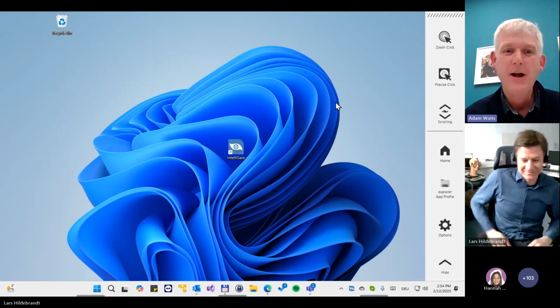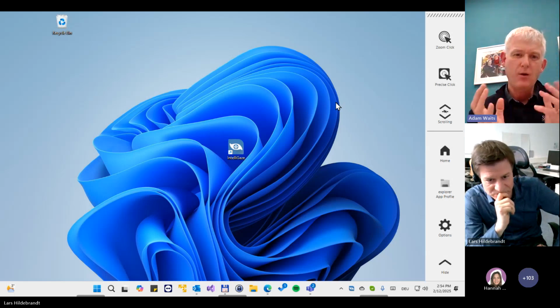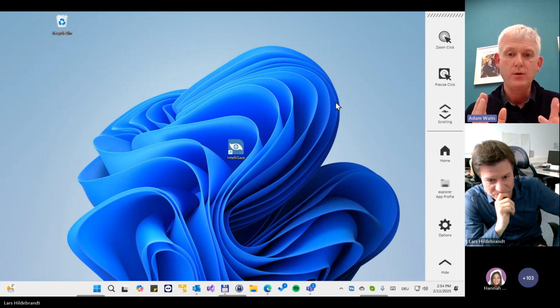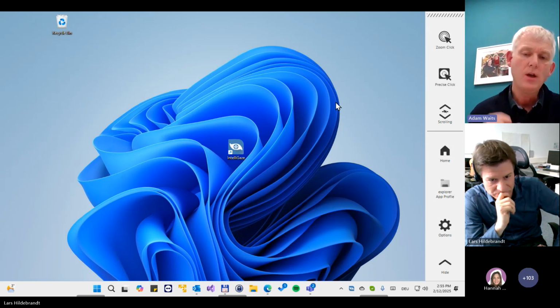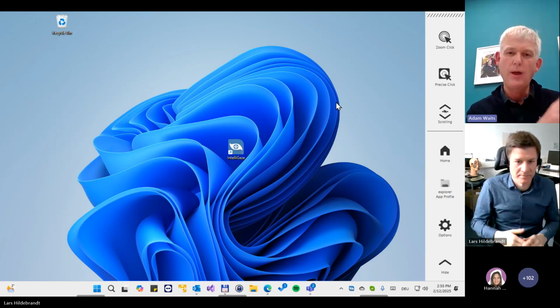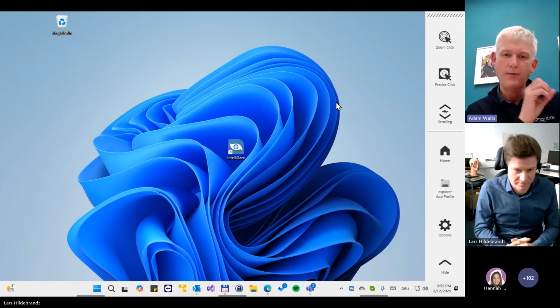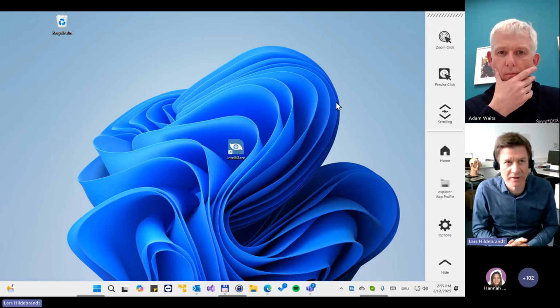So, another question: the forgiving calibration wait, is it long in Grid, or is there a difference when using IntelliGaze? When the calibration waits for the user to look, I think the question is, does it wait in Grid as long as in IntelliGaze? My feeling when I've used both is that it sits there and shrinks and waits for you before finally moving on. Yes, this is what it does in Grid as well, to my knowledge. That's how it's implemented there as well.